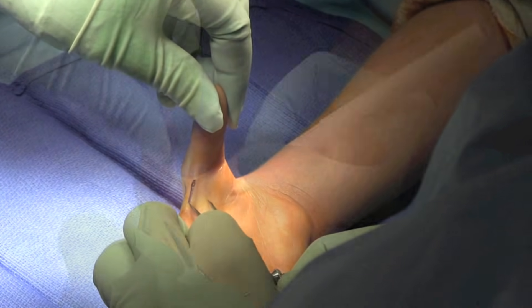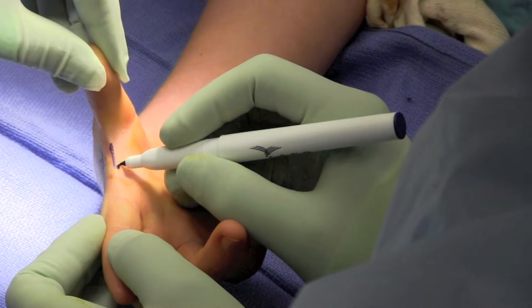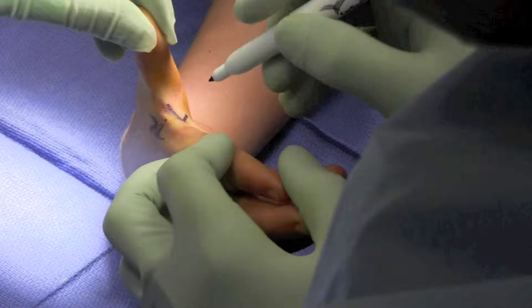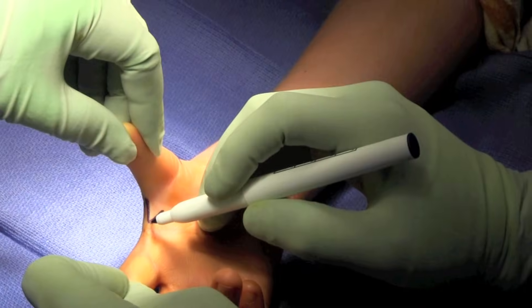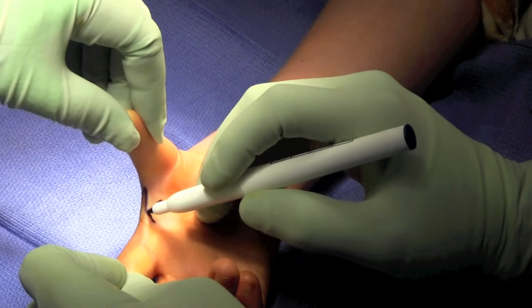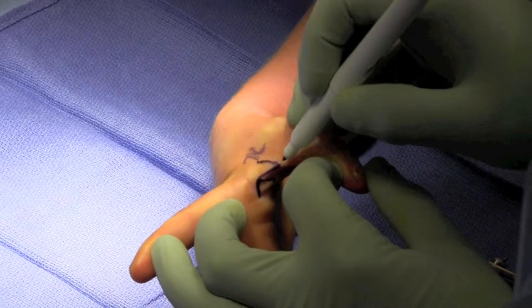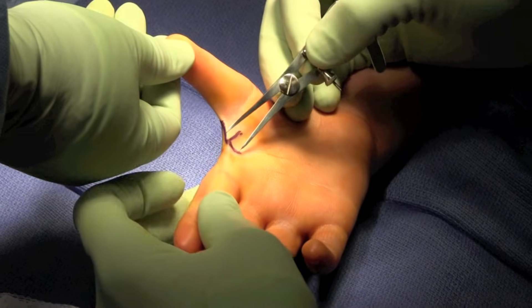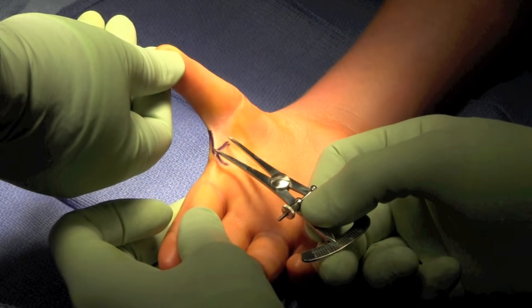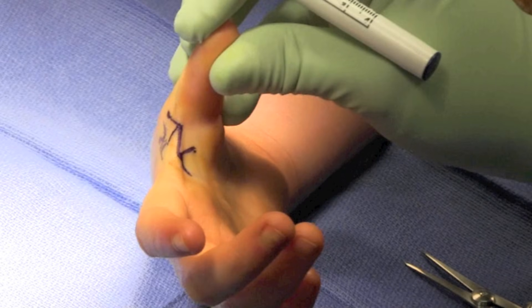An incision was made in the first web space with symmetric flaps — one at 90 degrees along the dorsal and volar aspect of the crease, and then an additional one at 45 degrees in a reciprocal fashion as shown here. This is a standard 4-flap Z-plasty, and we made sure that each of the limbs were of equal size to ensure adequate deepening of the first web space.